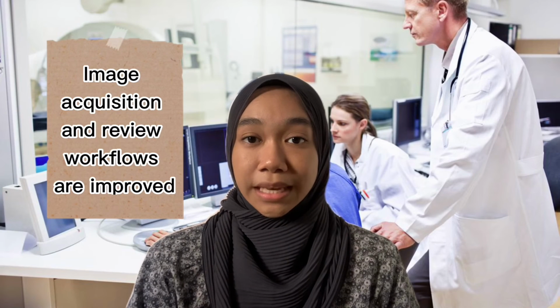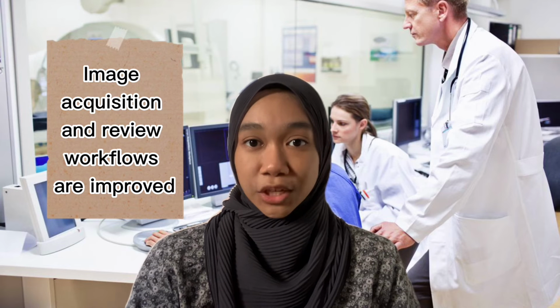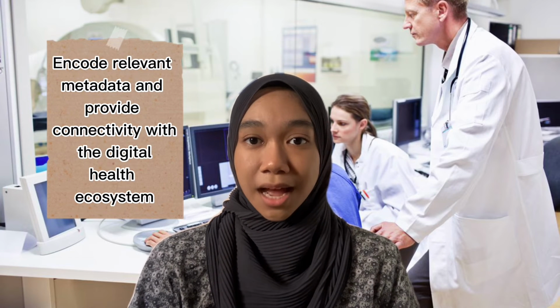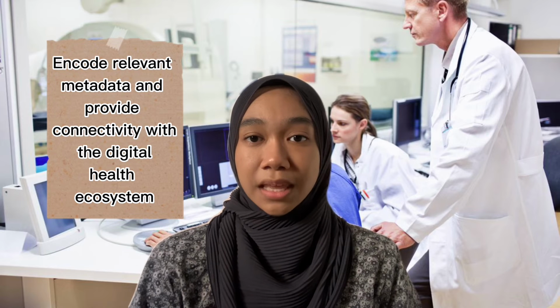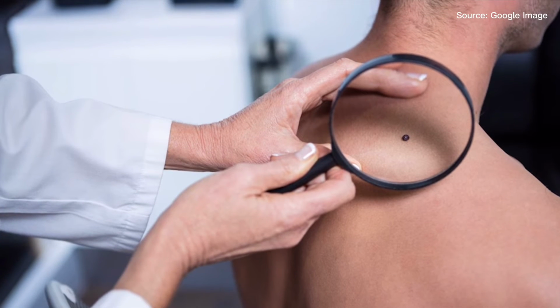Image acquisition and review workflows are likely to improve with the use of Dicom. The amount of time radiologists spend on image review has been shown to be significantly reduced without compromising diagnostic accuracy. Dicom's ability to encode relevant metadata and provide connectivity with the digital health ecosystem sparked initial interest in its use in dermatology.